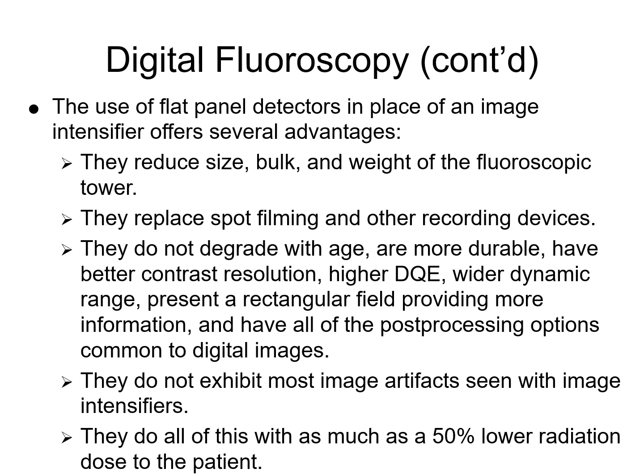So, a rectangular field versus a circular field. Yes, the flat panel array, along with the CCD, both of those are rectangular matrices. Okay, not exactly, most of the time exactly square, but not always. But we don't round. The image intensifier definitely has to round off the corners, and so you lose the corners in the monitor if it's image intensified fluoroscopy, whereas digital fluoroscopy with a flat panel detector broadcasts a rectangular image matrix. Okay, and so you don't round off the corners, and therefore you display more anatomy.